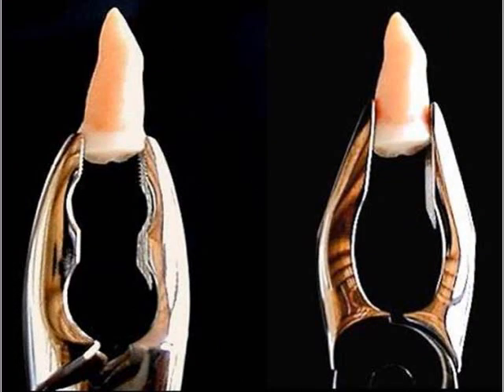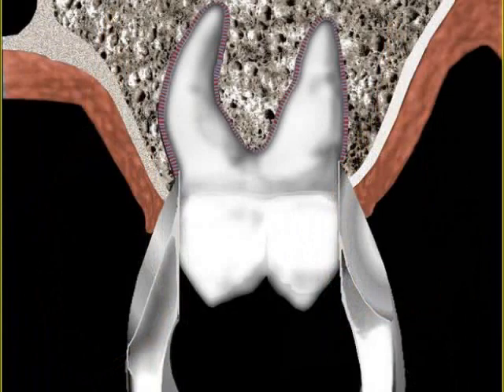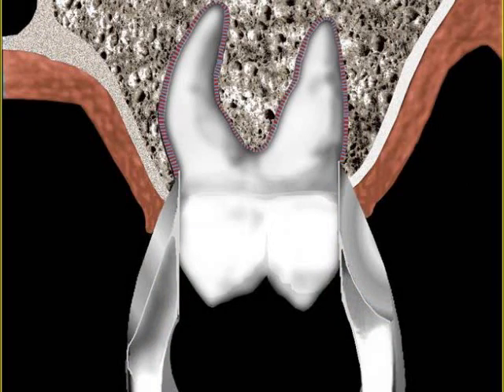The primary instrument I'm going to use in order to accomplish these extractions atraumatically is the apical retention forcep, which you can see in the photograph on the right. This forcep is designed and sold by Carl Schumacher Instruments, and it's designed with very slender beaks that allow it to slip subgingivally and get underneath the alveolar crest and engage the root further down on the root below the crown. This gives you much better leverage and a much better grip on the tooth in order to facilitate forcep extraction.